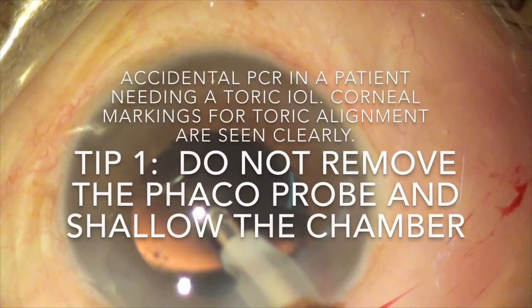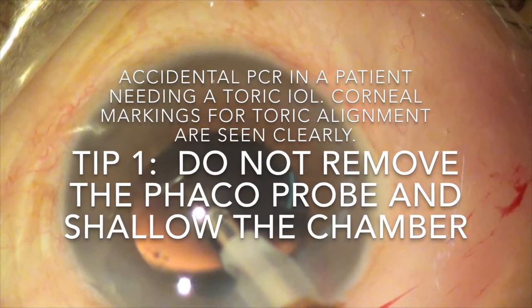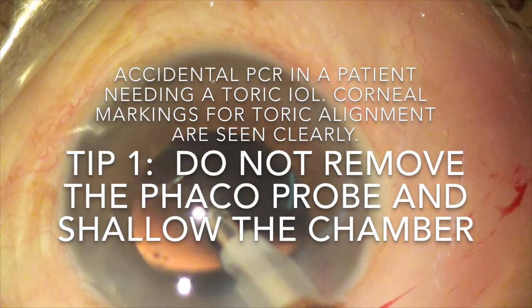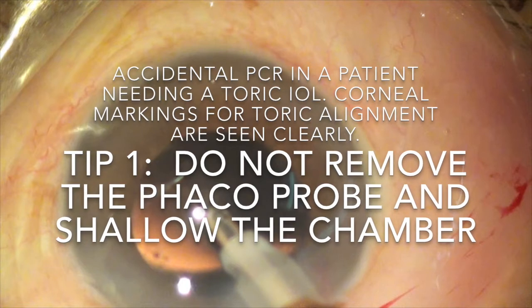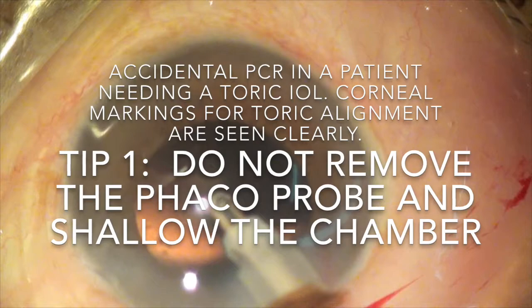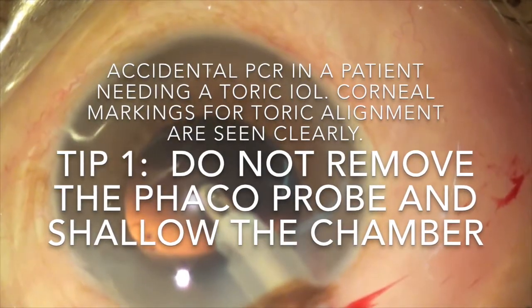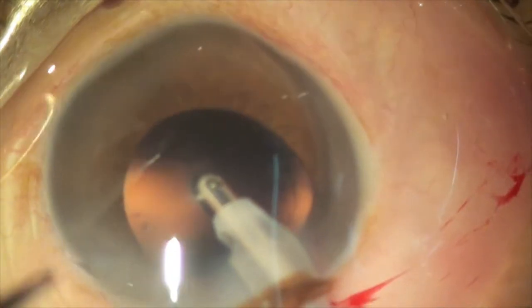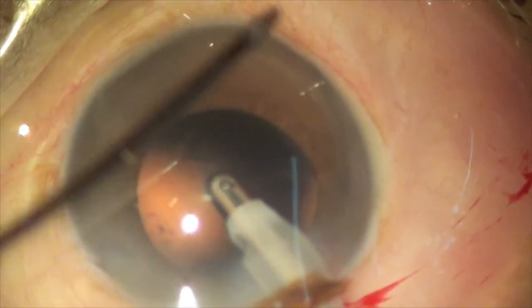Here we have a patient where I have an accidental PCR. I was planning to put a toric lens inside him. So the first tip is: don't remove the phacoprobe and make the anterior chamber shallow. Keep the phacoprobe inside the eye.